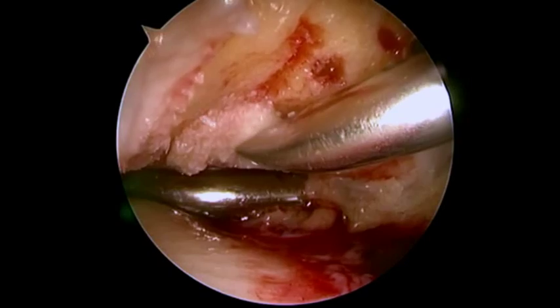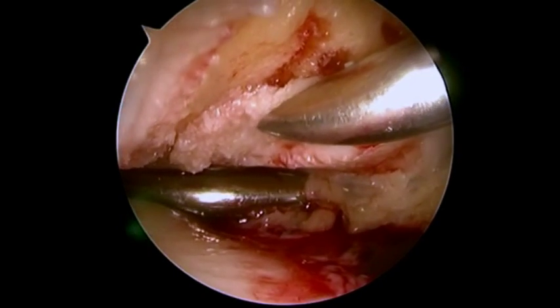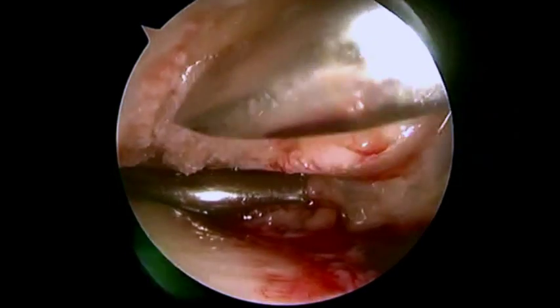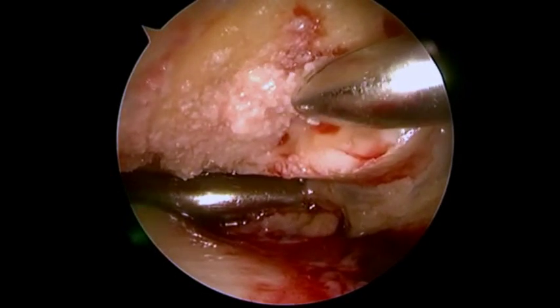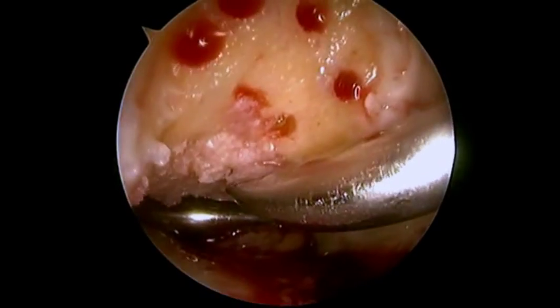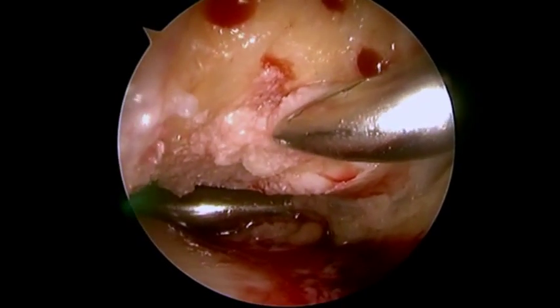Next, turn off the water and apply the BioCartilage. The bone should be as dry as possible, and it may be helpful to open your trocar to air, which will vent the joint. You can also use epi-soaked mini sponges to help with any remaining moisture.